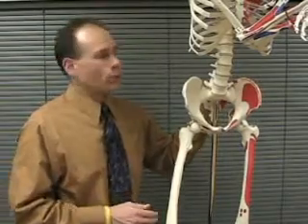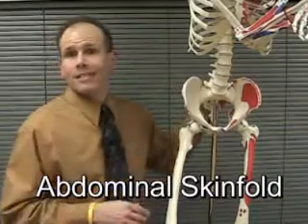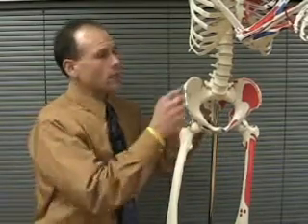Our other mid-body measurement, where we do have a vertical fold, is the abdominal measurement. A little hard to see here on my friend the Skeleton that doesn't have any tissue, but it's an easy one to pick out on your subject. The abdominal measurement is 2 centimeters to the right of the umbilicus, or the belly button. That's pretty easy to pick out. 2 centimeters to the right of the belly button. That's a little less than an inch. You can mark that site with a little bit of a mark like we've talked about before.